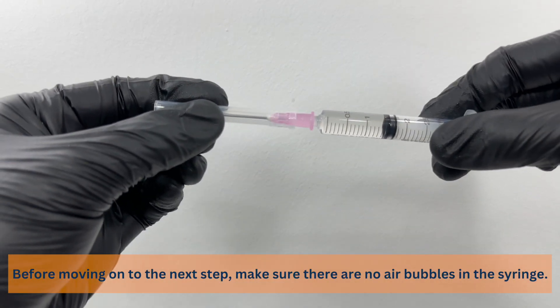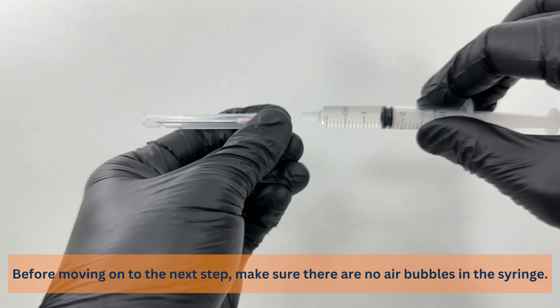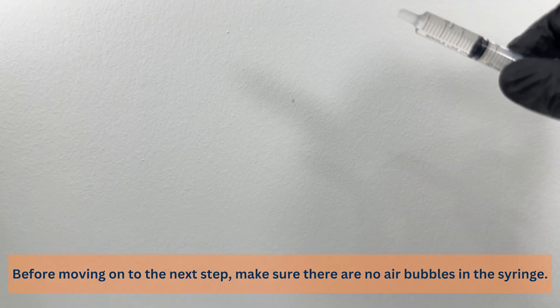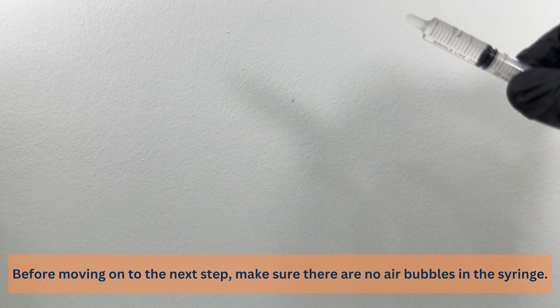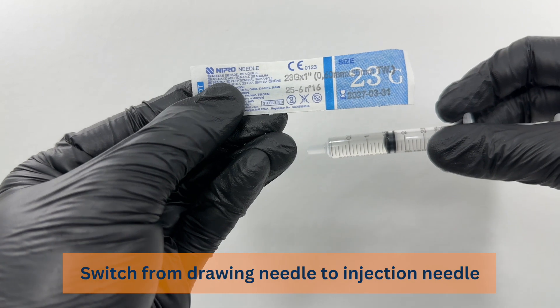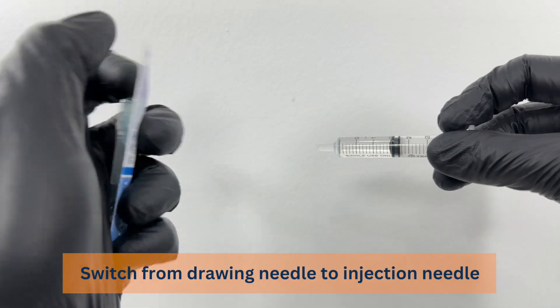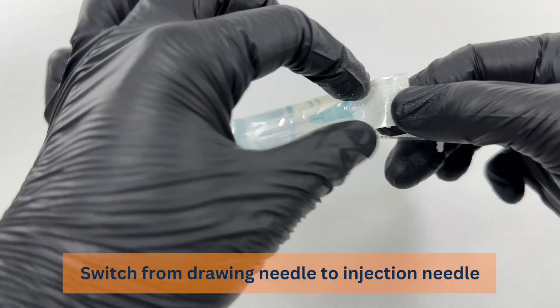Before moving on to the next step, make sure there are no air bubbles in the syringe. Now switch from the drawing needle to the injection needle.